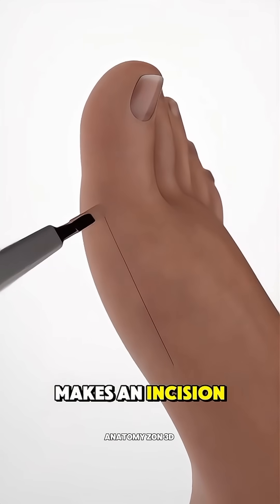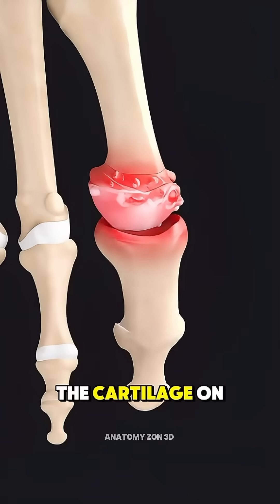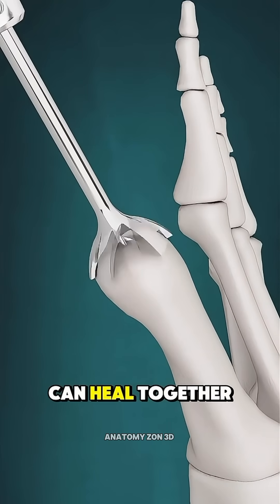The surgeon makes an incision over the top of the big toe to expose the damaged joint surfaces. The cartilage on both sides of the joint is removed to create fresh bone surfaces that can heal together.